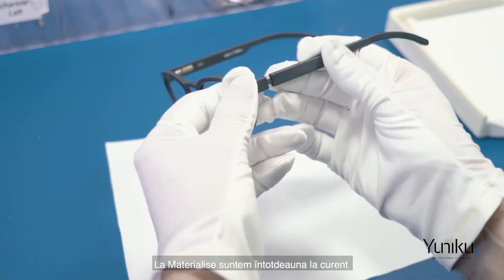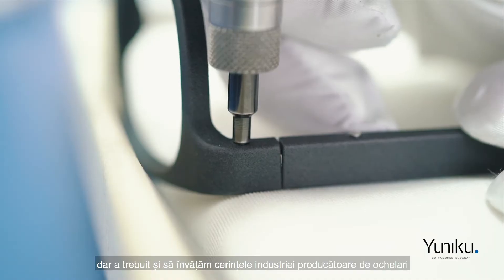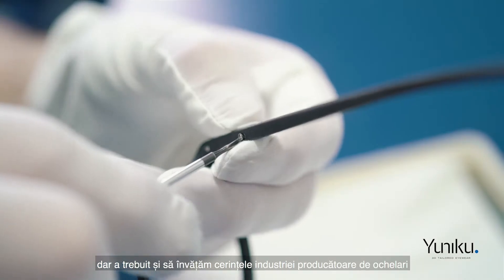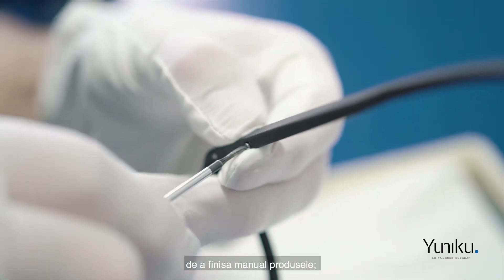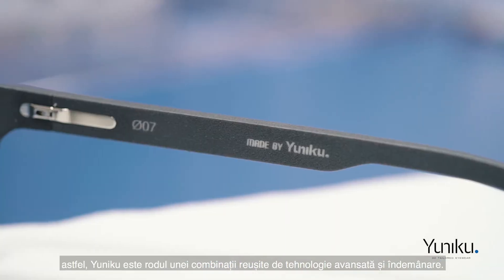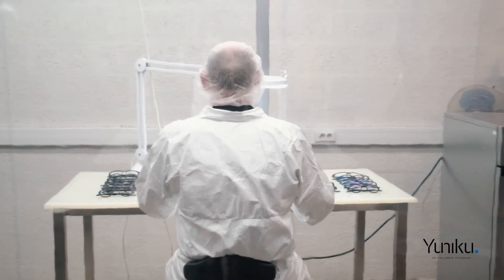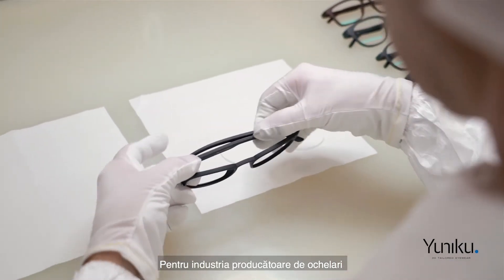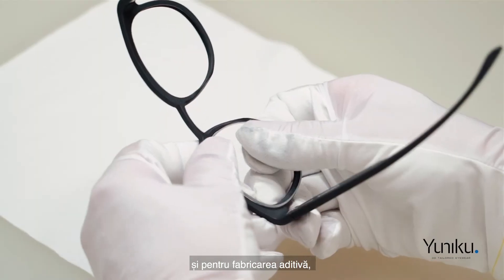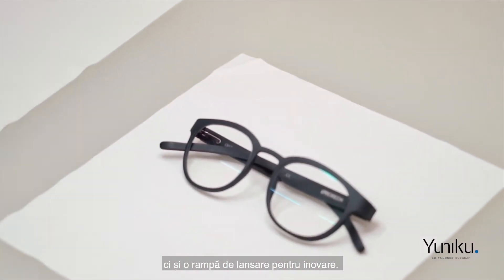At Materialise we are always there with the latest innovations in 3D printing, but we also needed to learn from the eyewear industry the requirements of finishing the product by hand — making Yuniku a successful marriage between advanced technology and craftsmanship. For the eyewear industry and for additive manufacturing, Yuniku is not only a design automation but a launch path of innovation.